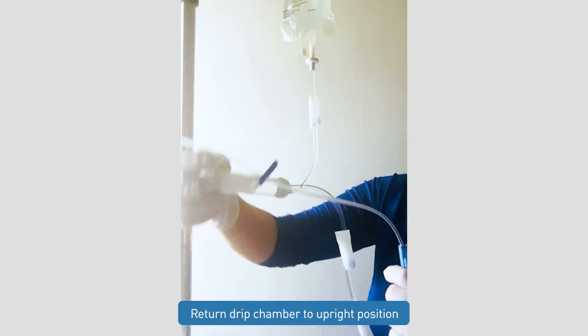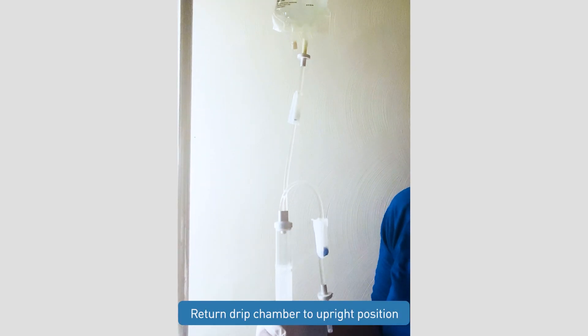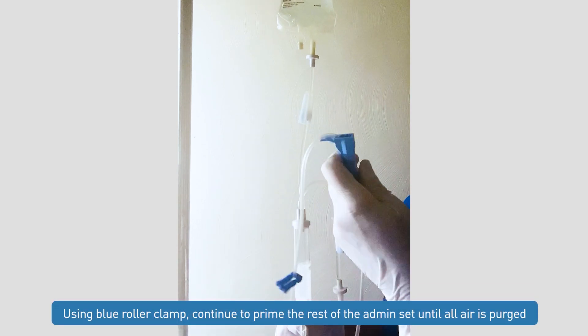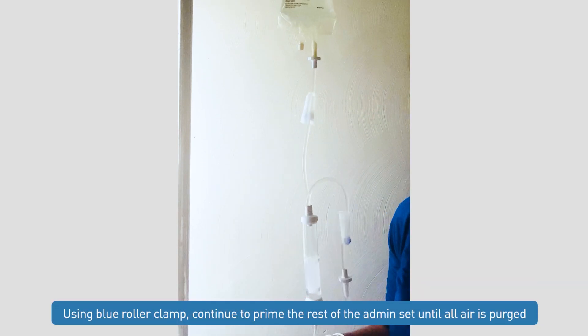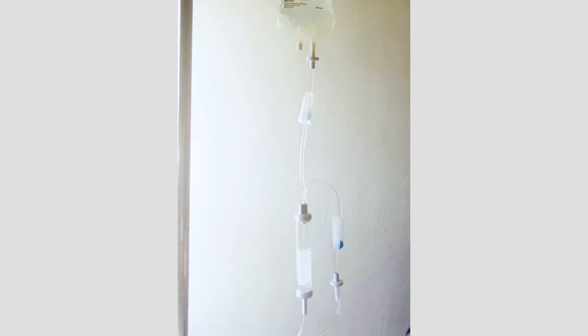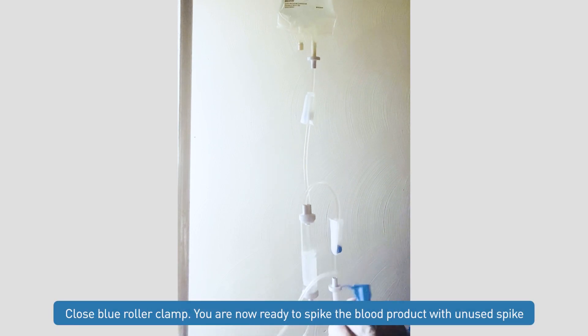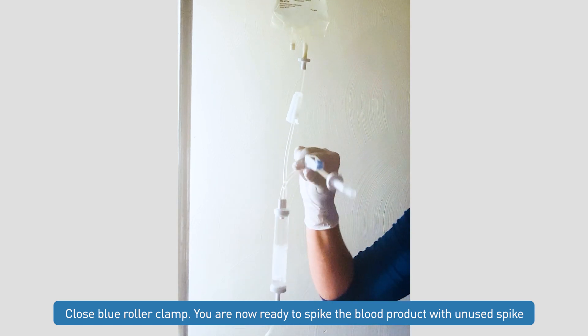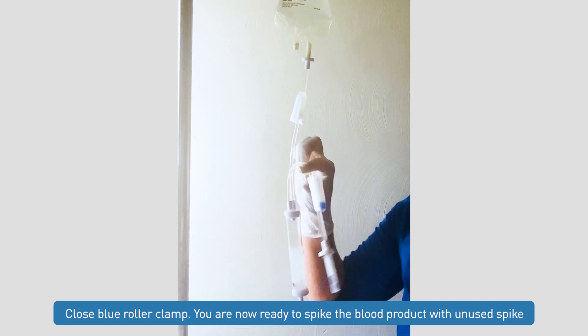At this point, we can return our drip chamber to the upright position. Using our blue roller clamp, we will continue to prime the rest of our administration set until we've purged all air. Once we've primed the rest of the administration set, we can close our blue roller clamp and we'll be ready to spike our blood product with our unused spike.